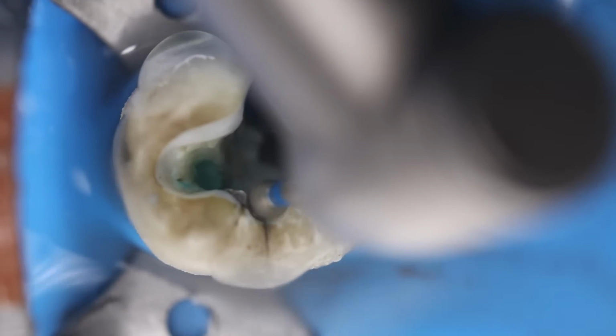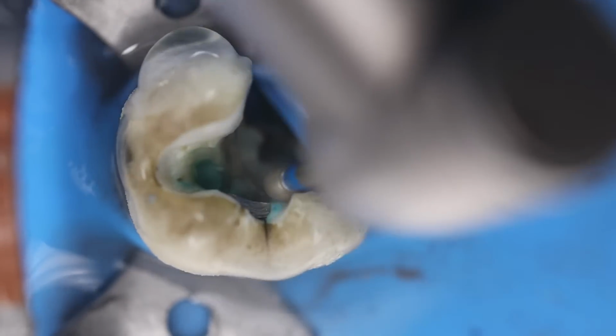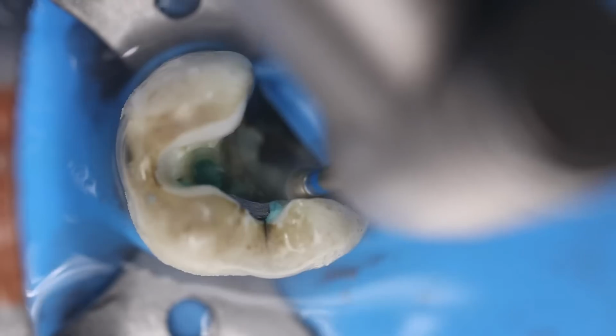Also removing the weakened tooth structure or the tooth structure that has been infested with caries. These all areas can be removed.